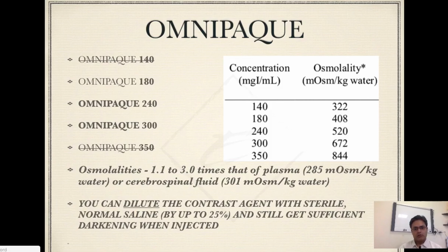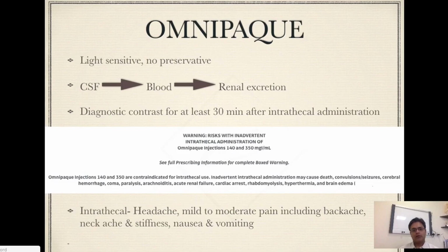Now, the important thing about this contrast, Omnipaque, is that it's light sensitive and there are no preservatives in it. And if it does end up going intrathecally for any reason, it can lead to side effects as well. And hence it's important not to be using the 140 and the 350 strength of Omnipaque where there is a chance of intrathecal uptake.